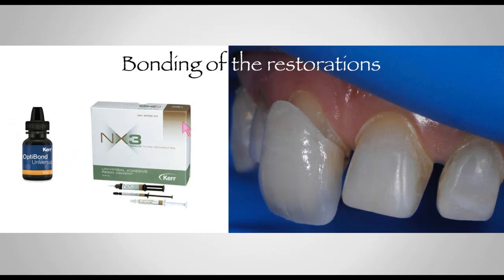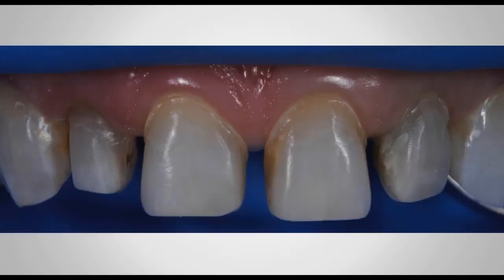I'm always going to use, for this type of restoration, a single bottle dental adhesive, because I want to have a very thin layer of adhesive. And then I choose a good system. In this particular case, I'm using NX3 light cure veneer cement. This is one cement that I like a lot, that has a try-in paste.